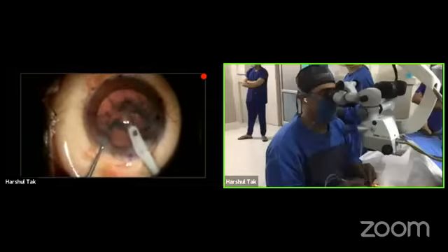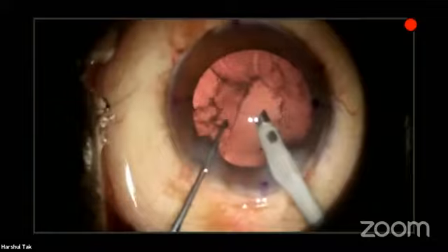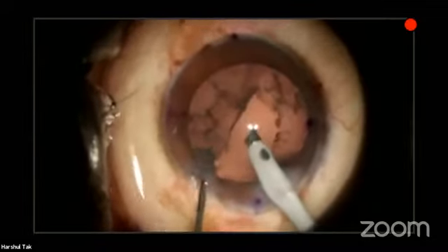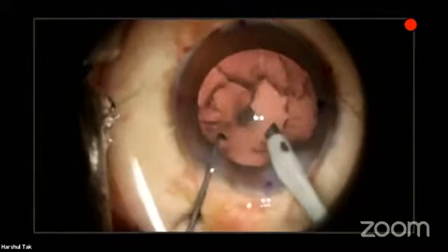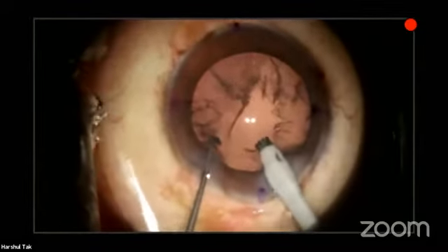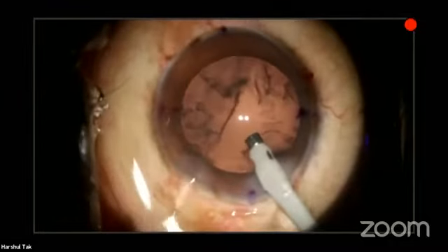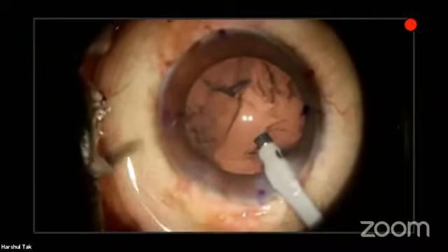So, the machine gives excellent chamber stability. You can see the last piece, but there is no change in the settings or whatsoever. And we finish off with the emulsification part. Visco, please. So once we are done, see the light mein dekhenge, bahut acha.